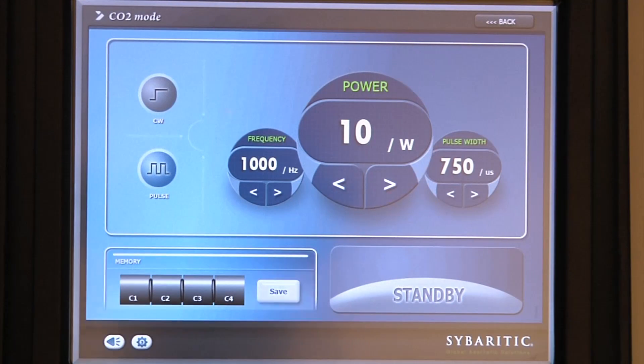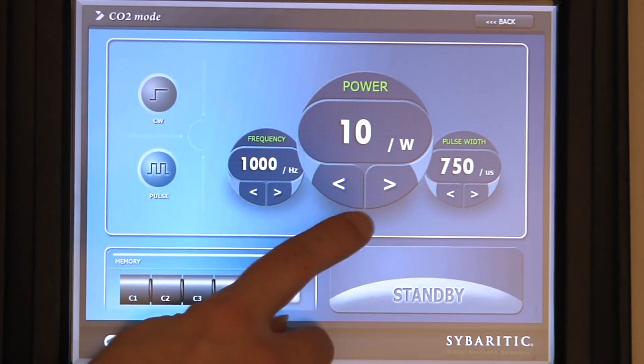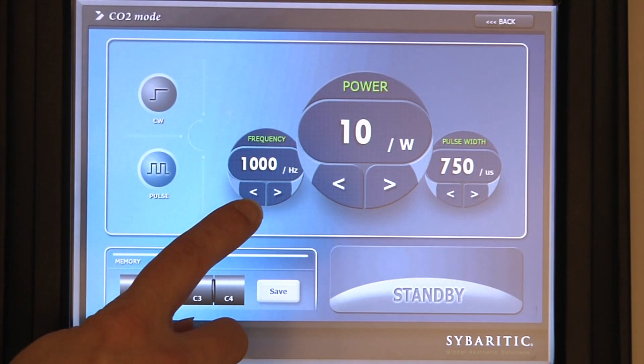In the CO2 mode of operation, we can choose between a continuous wave or pulsed waves. We set the power here with a range up to 40 watts. We can also control the frequency, the rate at which we are delivering pulses.